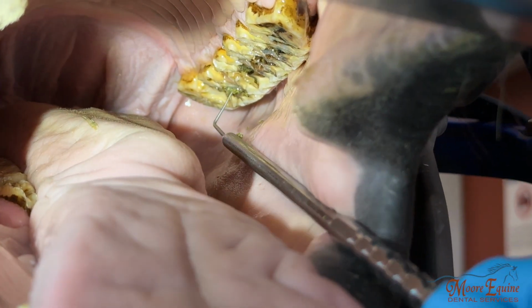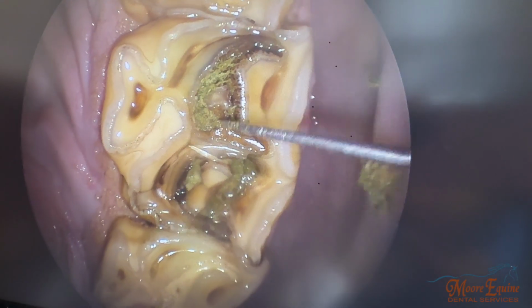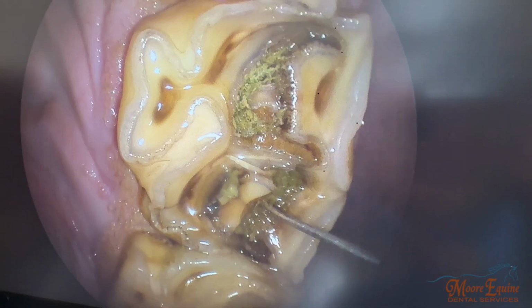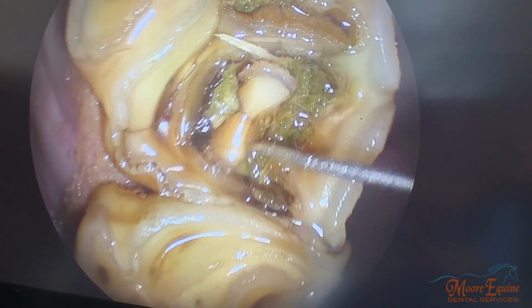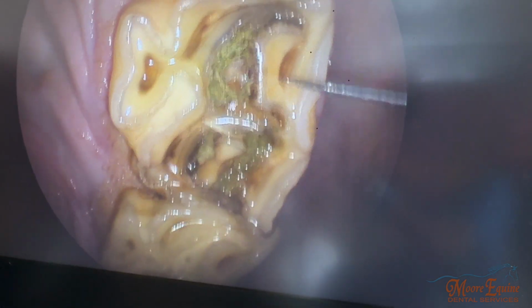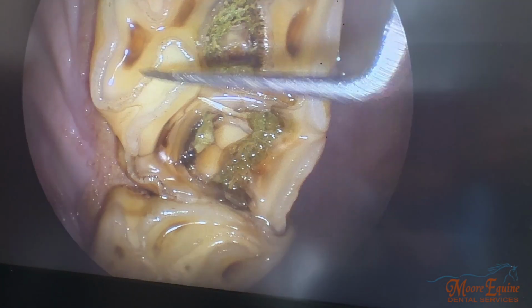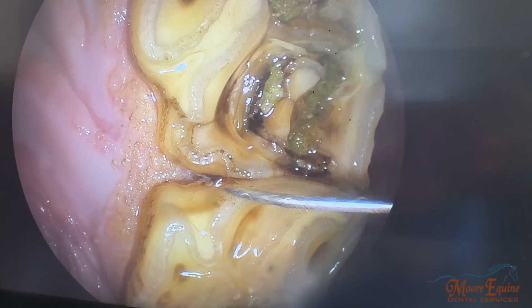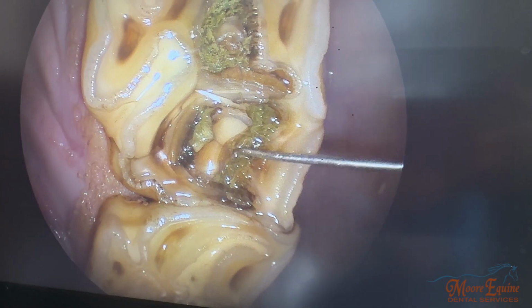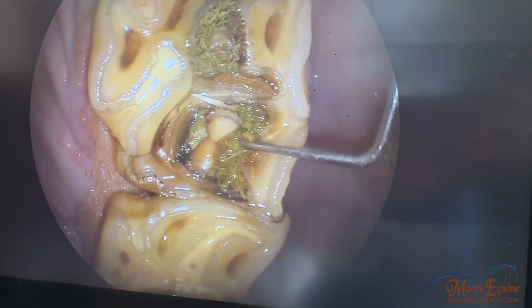And let's take a look a little bit further with the oral endoscope. Okay, so here we're looking at this tooth right here, the number 210. And this is something that you'll see that confuses people sometimes, but this is part of the tooth that's broken into this infundibulum. So here we have pulp number 1, pulp number 2, pulp number 3, pulp number 4 right here, pulp number 5. There's a little chip fracture on the tooth right here. But then there's this structure right here. So this is part of the infundibulum that's broken.